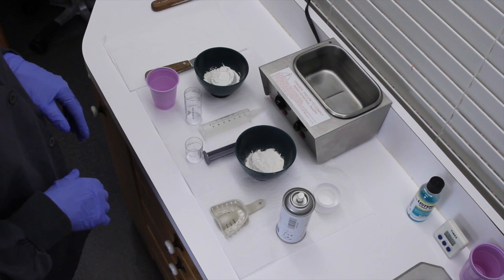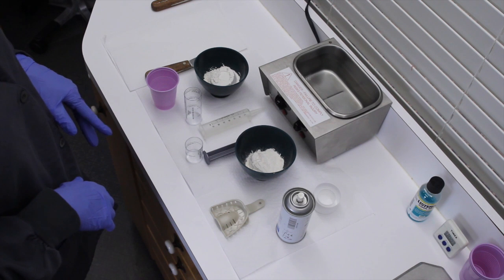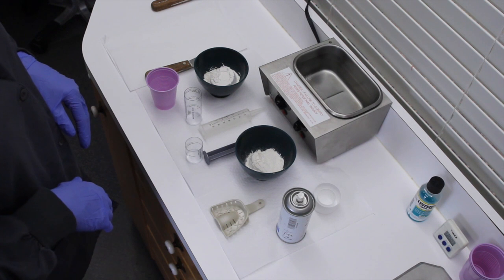Okay, now that we have the tray properly fitted, the patient's mouth is cleaned and ready for the impression. Now we begin the process of actually mixing the alginate. Beforehand, a couple quick words about that. There are different ways of mixing alginate. There are alginators, there's hand mixing, and that's really up to the individual. I find with my assistants, they do a wonderful and consistent job by hand mixing. If you want to use an alginator or whatever kind of mechanical devices you need in addition, you feel welcome to. We're going to demonstrate just using a manual process.